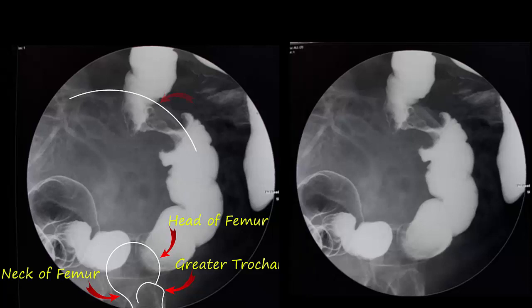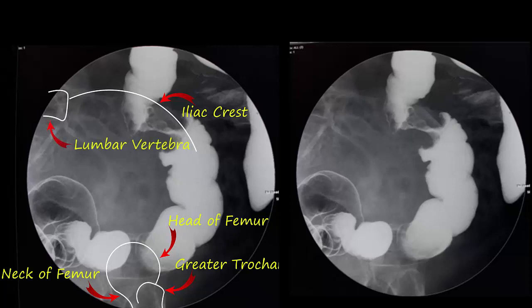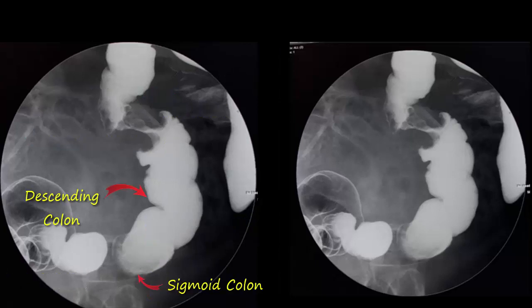This bony structure would then be the iliac crest of the pelvis, and this would be a lumbar vertebra. Is it the right lower quadrant or the left lower quadrant? If it was the right side, we should be seeing the cecum, which has a totally different appearance to what we currently see. So this is certainly the left lower quadrant, which makes this the sigmoid colon, and the lesion is in the distal part of the descending colon.